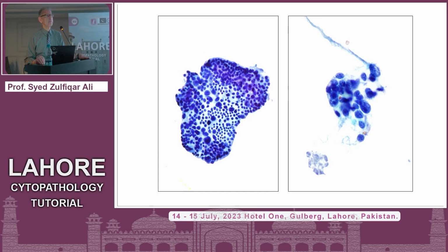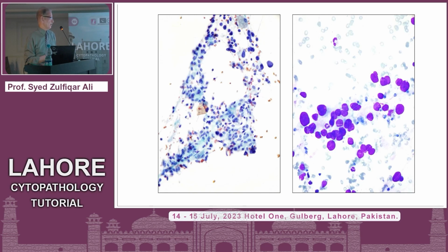So, very clean background. But the cells look a bit pleomorphic. You can see the nucleus size. Some are small, some are intermediate, some are significantly larger, very hyperchromatic. Well, one thing is they are forming syncytium, meaning they are fused together. And these are conventionals, again showing you size variation, very clean background, macronucleoli, again adhering to each other.